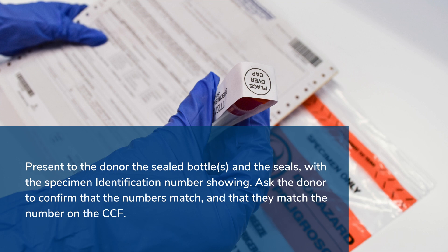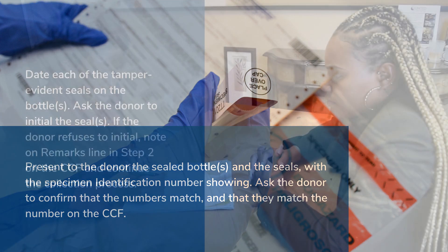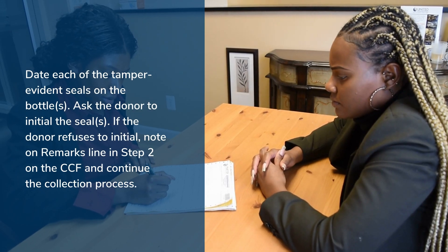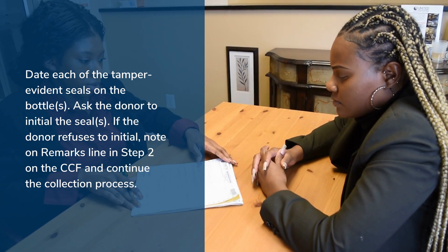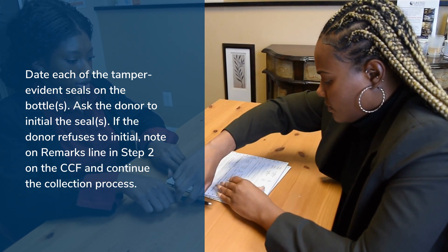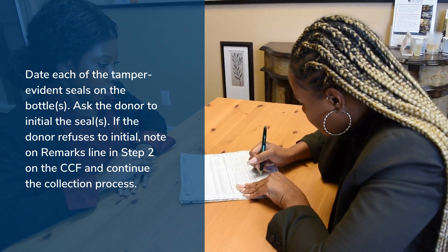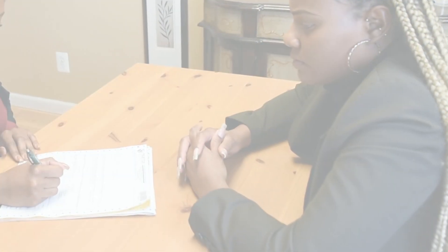Present to the donor the sealed bottles and the seals with the specimen identification number showing. Ask the donor to confirm that the numbers match and that they match the number on the CCF. Date each of the tamper evidence seals on the bottles. Ask the donor to initial the seals. If the donor refuses to initial, note this on the remarks line in step 2 on the CCF and continue the collection process.